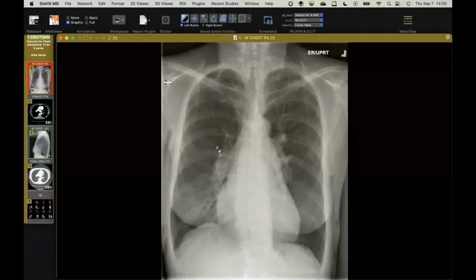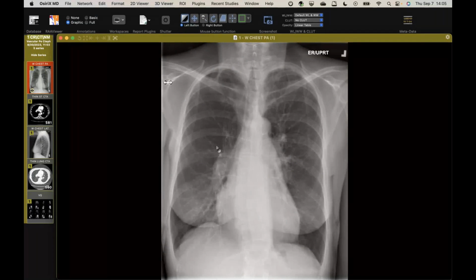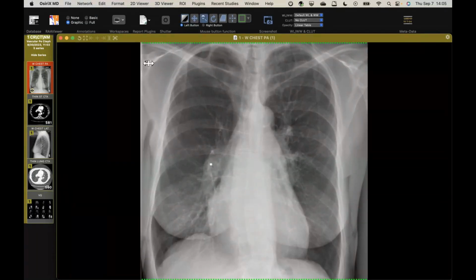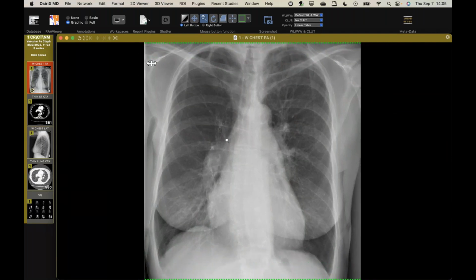So this patient had no previous imaging, was in her 70s, and presented with shortness of breath to the emergency department. And you look on the radiograph, you can see that the central pulmonary arteries are a little big. The interlobar in particular is quite large. And there's relative lucency here in the right upper lobe. You might wonder about emphysema. The vessels are small or something else going on there.